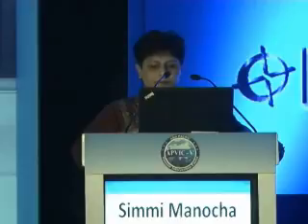The various machine presets: there are automatic presets given by the company from which we can pick the desired work we want to do, whether we want to do carotid Doppler imaging, an arterial Doppler, or a venous Doppler. All kinds of presets are already loaded on the machine for peripheral work. Presets are programmed to optimize the images based on certain gain, power setting, focal zones, frame rate, and other settings. We can choose the correct preset before scanning.